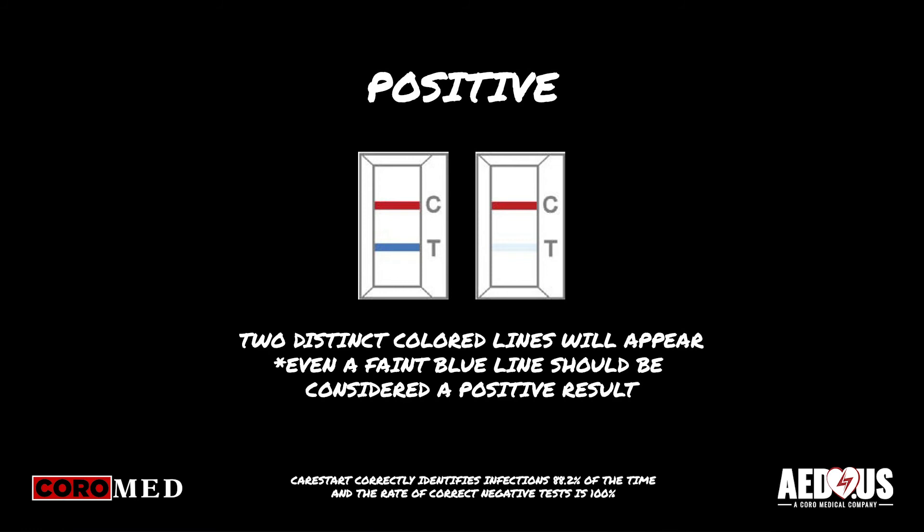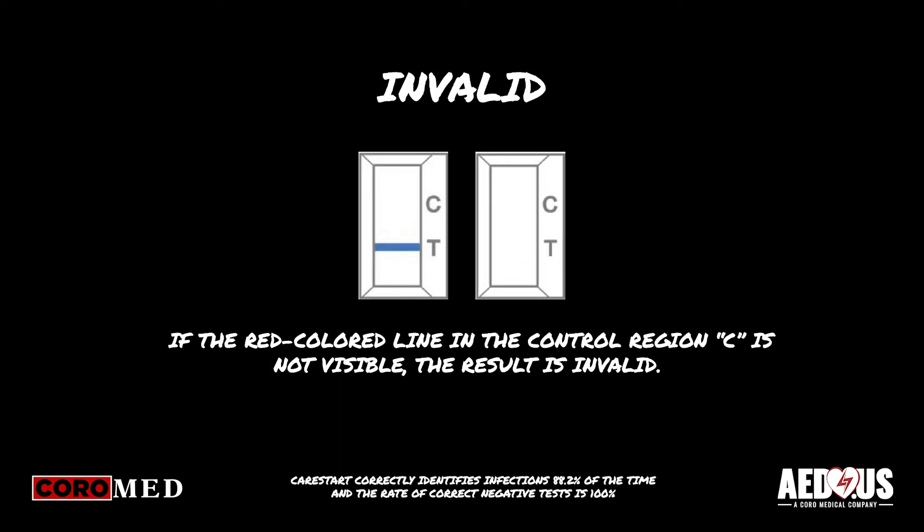Had this been a positive case, you would see two distinct colored lines appear — one red colored line next to the C and one blue colored line next to the T, indicating a positive result. If the red colored line in the control region C is not visible, the result is invalid.